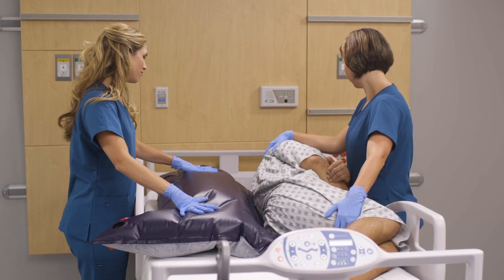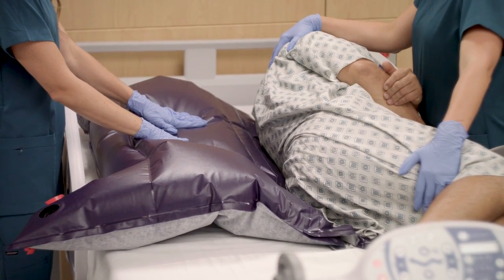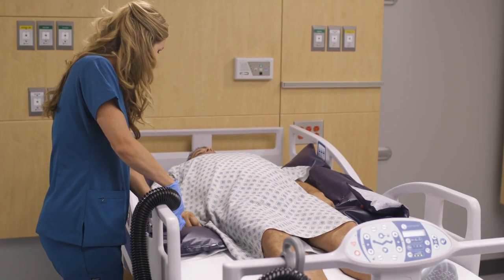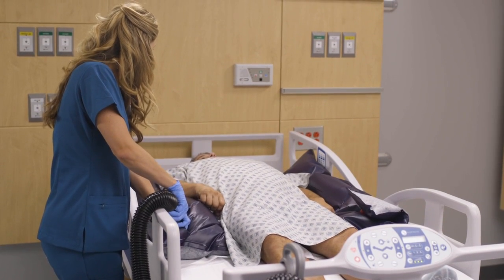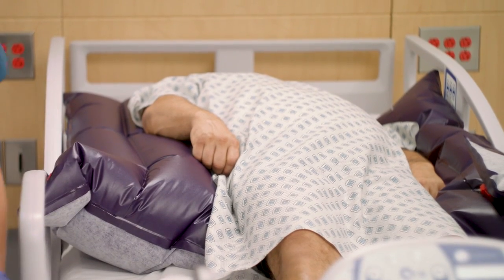Always use a minimum of two caregivers when using the Q2 Roller to position the patient for hygiene or wound care. One caregiver may be used to reposition for pressure relief if both bed rails are raised and the patient is not exceeding a 30 degree turn.